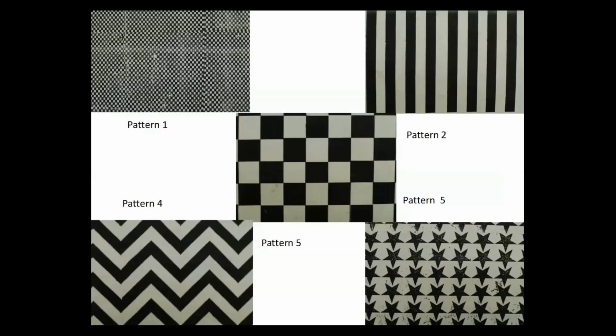For example, if you look for these patterns, there are 5 patterns. You have to make a board, some kind of checker board with these patterns. When you move the patterns in front of the patient's eye, you can get the discharges. Patients who react to these patterns should avoid watching movies with rapidly oscillating images, or games with this chessboard kind of pattern. In those patients, these patterns will provoke seizures. So when you do this pattern stimulation in these children or patients, you can get this abnormality.